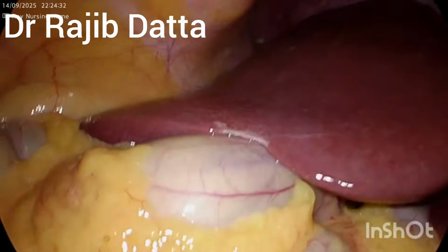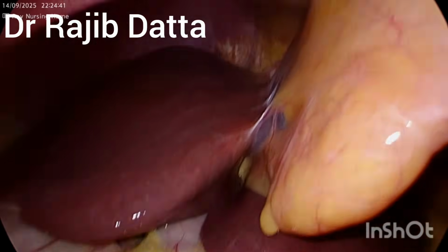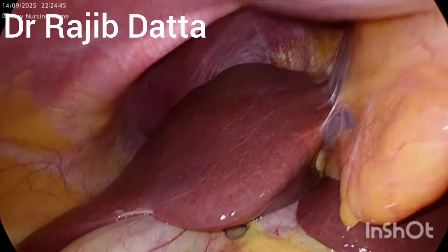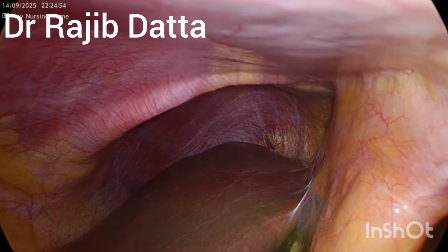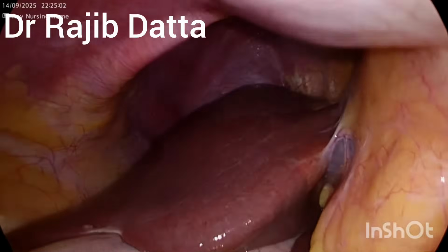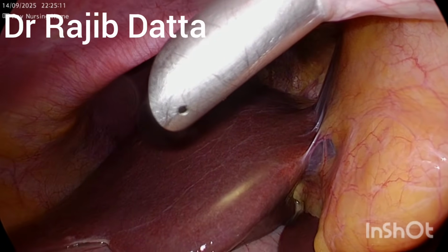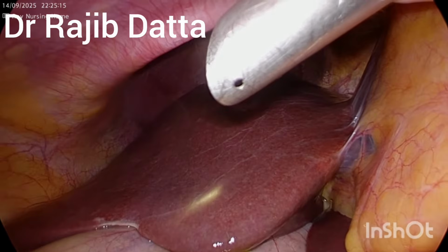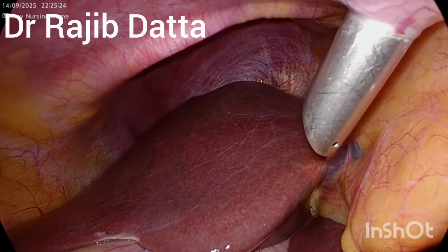Through the epigastric port, you can observe the transverse colon, the ascending and descending colon, the liver, the falciform ligament, and the distended gallbladder. Now we are going to introduce the 10 mm mid-epigastric port. It has been introduced, and with pneumoperitoneum the pressure remains 10 mm of Hg and the flow rate remains 9.